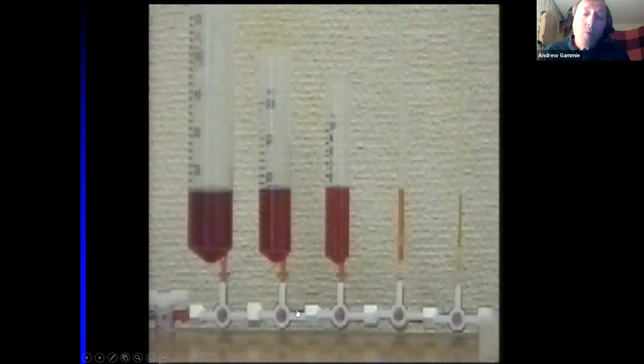What's happening here? Well, gravity is pulling on the water. And if I were in a room with you all now, I would ask you, what direction does gravity work in? It's the trickiest question of the evening. It's vertical. And so the force that is creating the pressure on my ears is only acting vertically. And so the change in pressure is going to be determined by the vertical height of water above me.